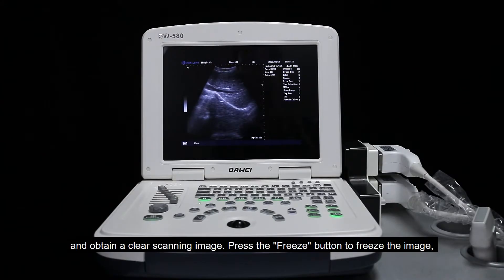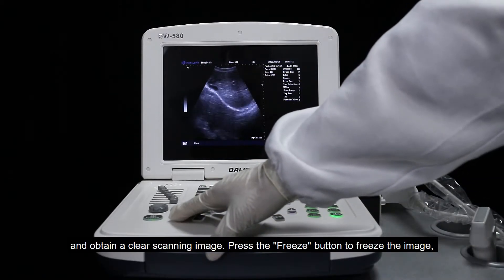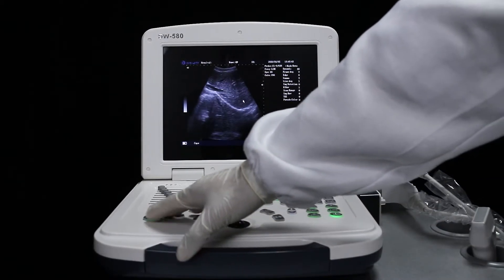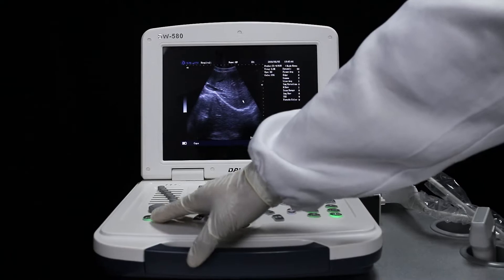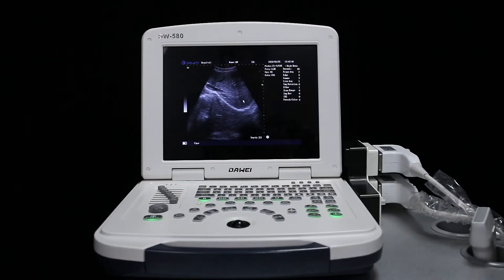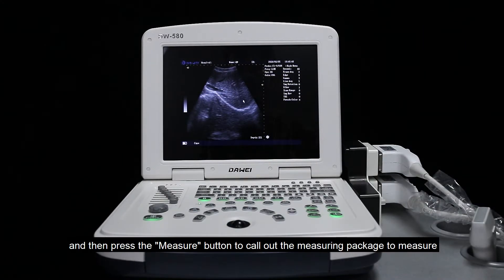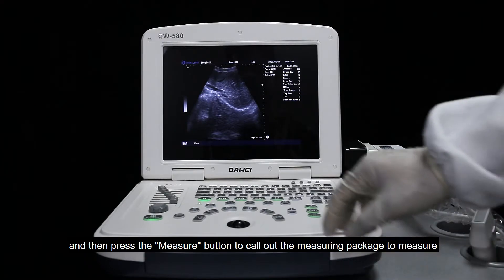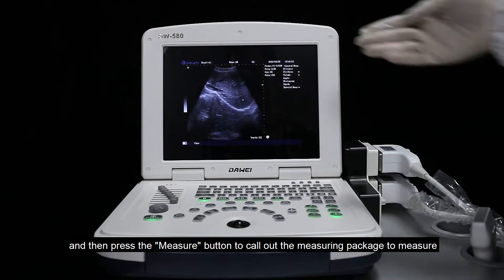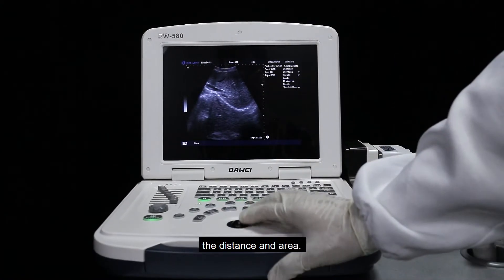Press the freeze button to freeze the image. Then press the measure button to use the measuring toolkit to measure the distance and area.